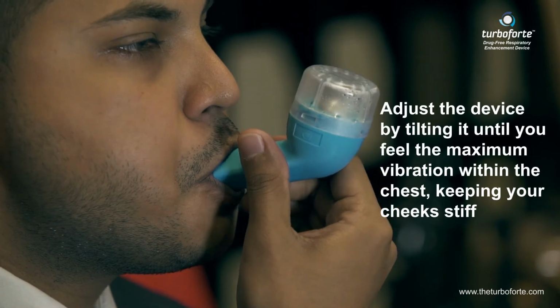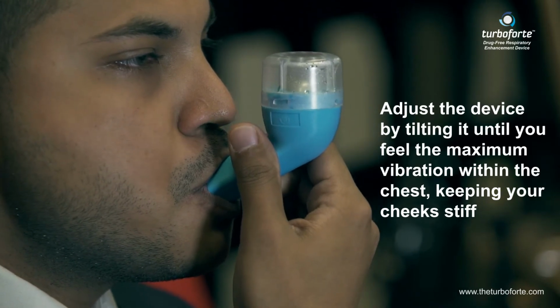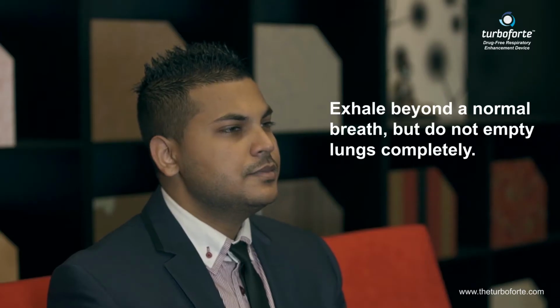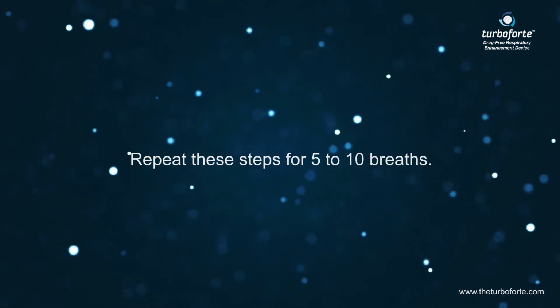5. Adjust the device by tilting it until you feel the maximum vibration within the chest, keeping your cheeks stiff. 6. Exhale beyond a normal breath, but do not empty lungs completely. 7. Attempt to suppress any coughing. And 8. Repeat these steps for 5 to 10 breaths.